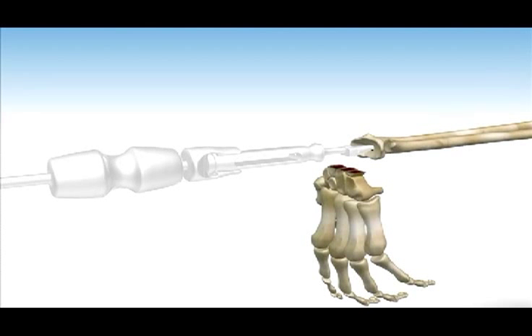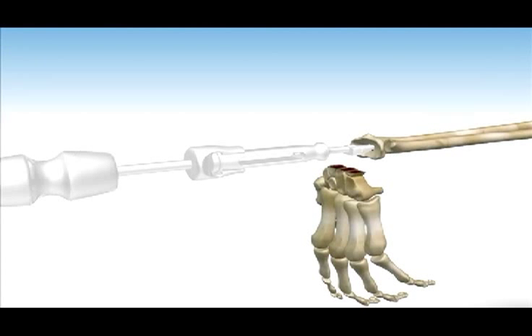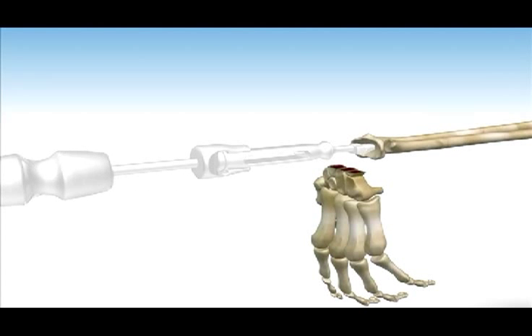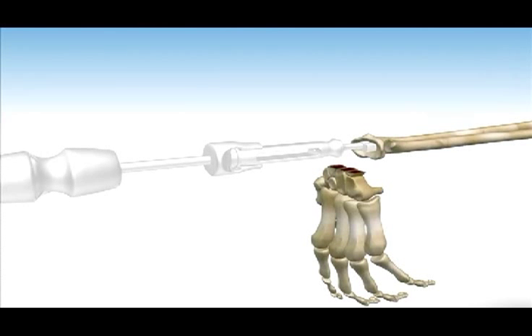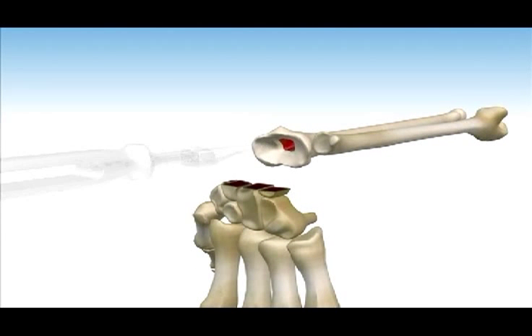Based upon the preoperative assessment, the distal radius is broached with increasing sized broaches to allow full seating of the radial component. Care should be taken to make sure the angle of the broach is aligned with the long axis of the radius. The broach may need to be withdrawn to clean the teeth and clear the intramedullary cavity of debris. Burring may be needed in the radial styloid region to prevent ulnar migration of the broach during impaction.